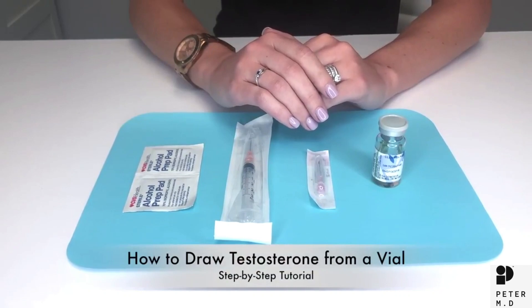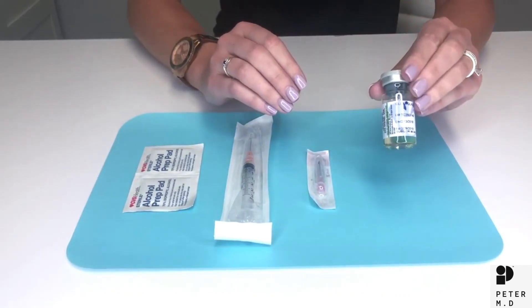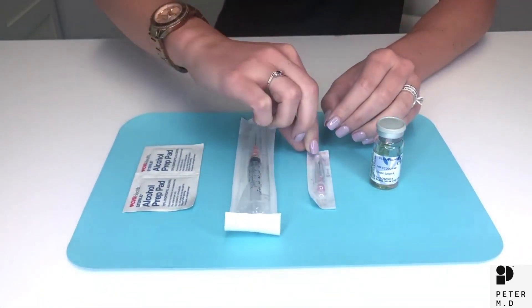How to draw up testosterone. When you first receive your testosterone package you will see your testosterone vial, the injection syringe, and the drawing needle.